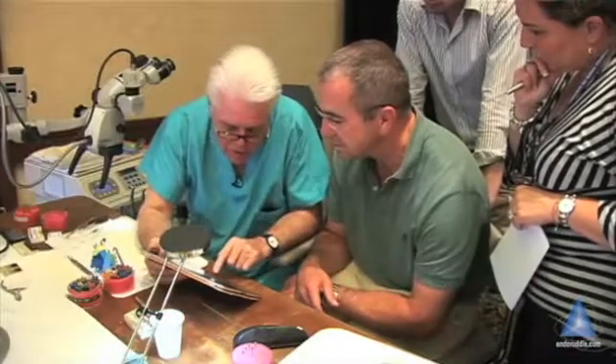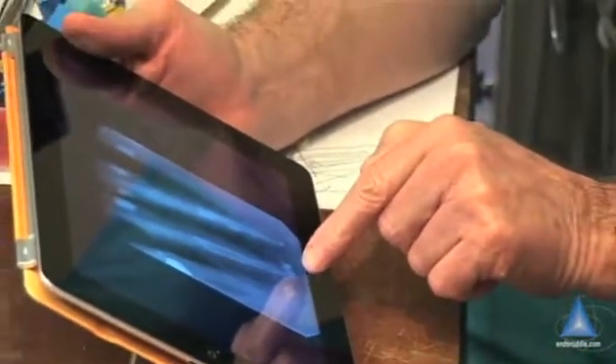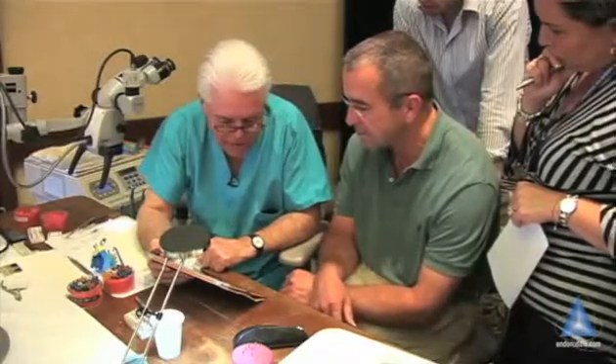You probably would tell me you like this puff better than that puff. I like them both. A puff is a puff. There's a puff, there's a puff — this one's bigger. But you don't know down here what's going on. You could have three exits, four exits, two exits — it looks complicated. We can't see it perfectly because it's hidden inside the sealer. But if it's sealed, the body can tolerate surplus after filling. It's irrelevant.